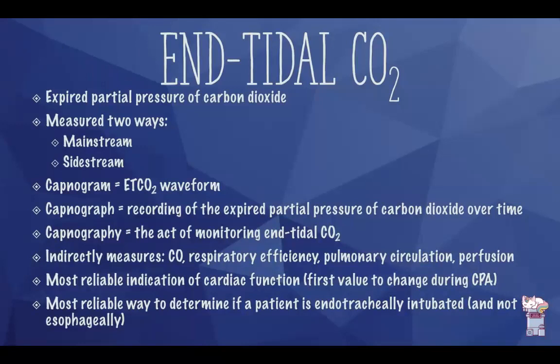End-Tidal CO2, or the expired partial pressure of carbon dioxide, is measured in two different ways, either mainstream or sidestream capnography. The capnogram is the end-tidal CO2 waveform, while the capnograph records this waveform, the expired partial pressure of carbon dioxide, and how it changes during the respiratory cycle over time. Capnography is the act of monitoring end-tidal CO2.